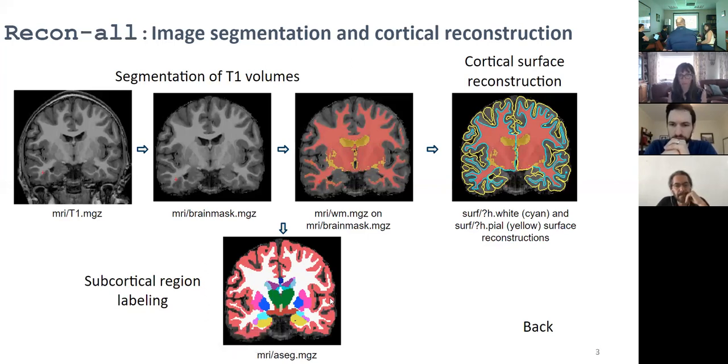And it seems that parcellation does have, at some point, not on an individual level, but from past research, a sort of functional basis, whereas segmentation is a more structural basis. Like white matter, gray matter. Parcellation is like, we know this is the motor cortex. Yes, although that is true.